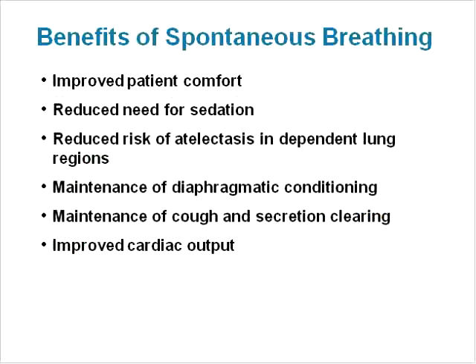Another major benefit of spontaneous breathing during any mode of ventilation is the resulting improved patient comfort. Improved comfort may lead to a reduced need for sedation. Studies have reported up to 70% reduction in the use of neuromuscular blocking agents and 40% reduction in sedation requirements compared to conventional ventilation. Furthermore, regular spontaneous breathing maintains diaphragmatic muscle condition and improves cardiac output. The patient can freely cough during mandatory breaths, contributing to secretion clearance and possibly reducing the risk of ventilator-associated pneumonia. All of these factors contribute to the potential for decreasing the duration of ventilation.